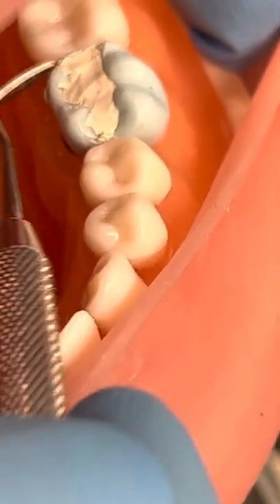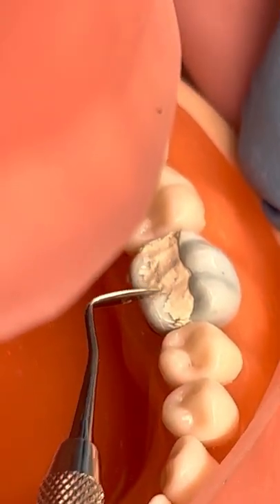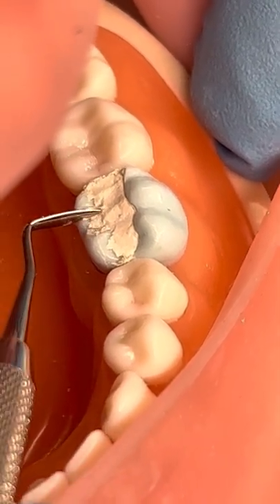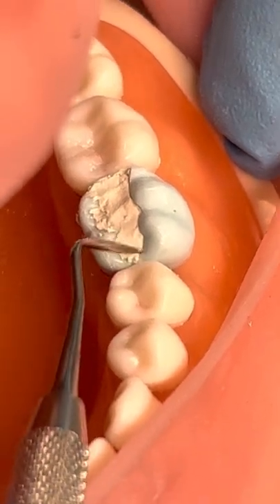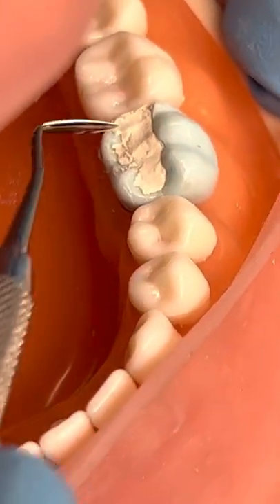We would just clean up a little bit on top — any flashing that's over top — make it nice and clean right there going along that cavo surface margin, making sure it's clean. Then I like to finish it off with a little bit of alcohol on top when I'm done, because it kind of seals it up and makes it nice and shiny.